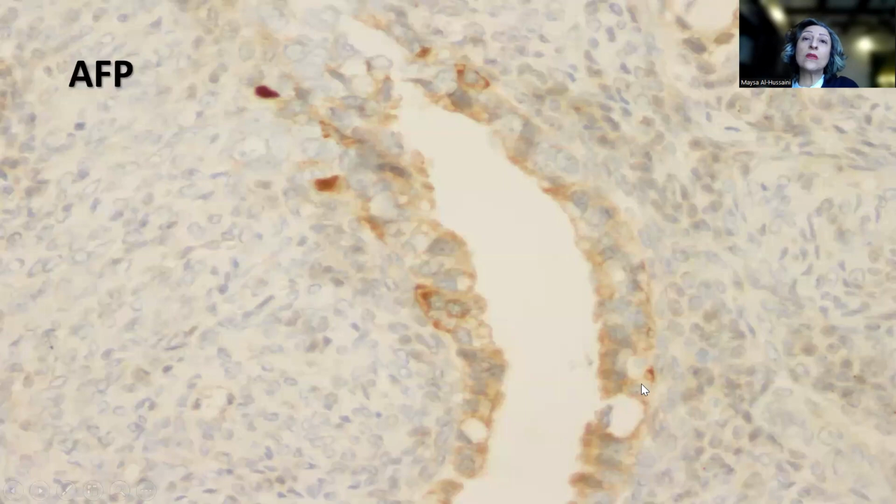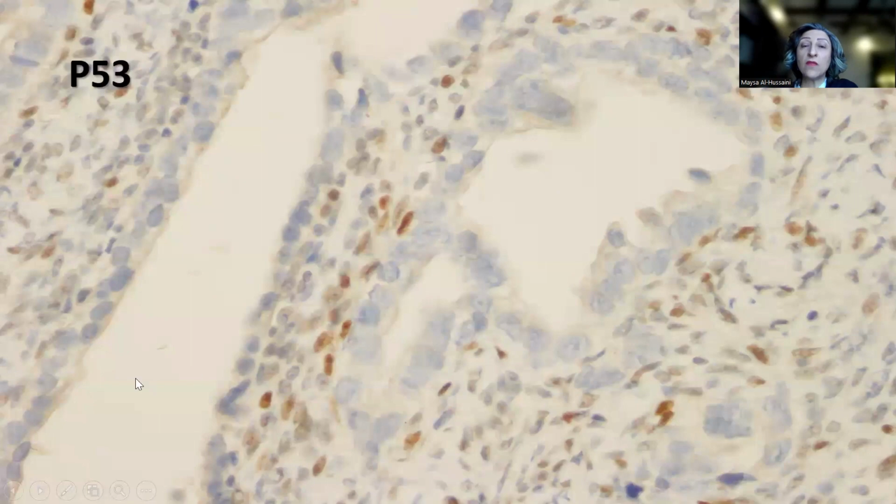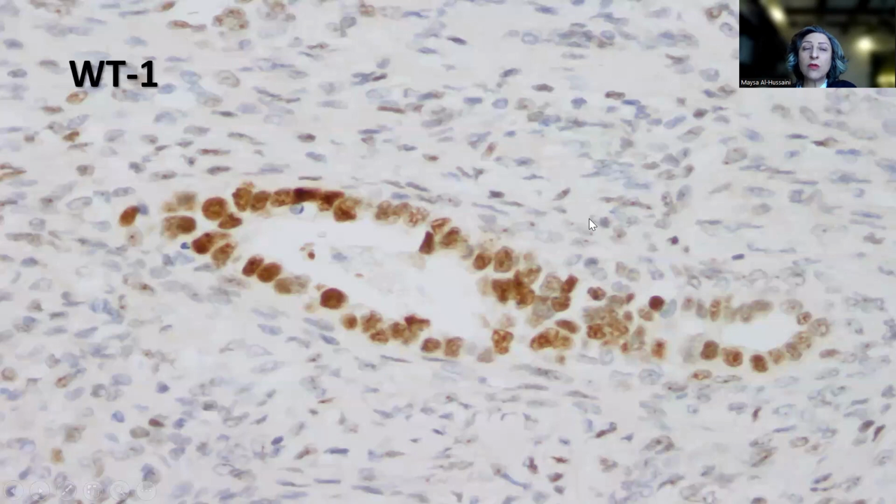And in yolk sac tumors arising in adult patients, this is the typical triad in immunohistochemistry, where we find strong positivity for SALL4, strong positivity for glypican-3, and focal positivity, weak focal positivity for alpha-fetoprotein. OCT3/4 was only focally positive. Now, p53 showed a null type staining pattern, meaning that this is an abnormal expression of p53, or what we call a mutant p53 expression.